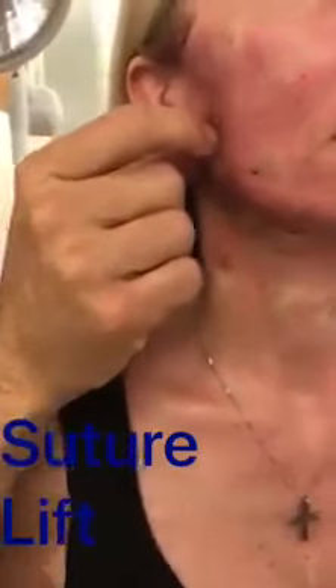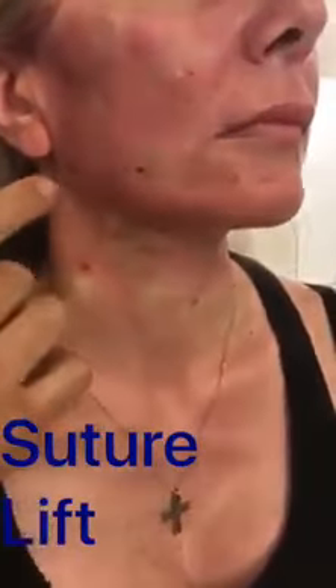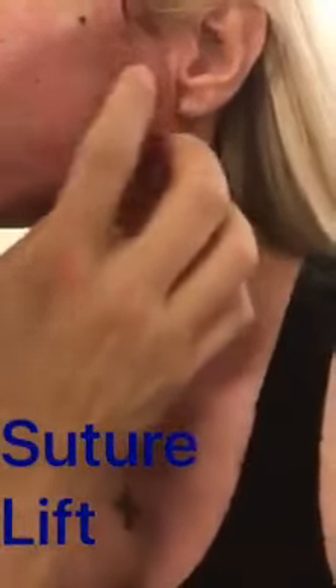What you're going to see immediately after is this puckering of the skin anterior to the ear and to the neck, where the skin has been moved into it. This will disappear in approximately a week and the skin will be redistributed back to the neck. The same on the other side — you can see even more of this area of skin that is being gathered up and it will be redistributed back.